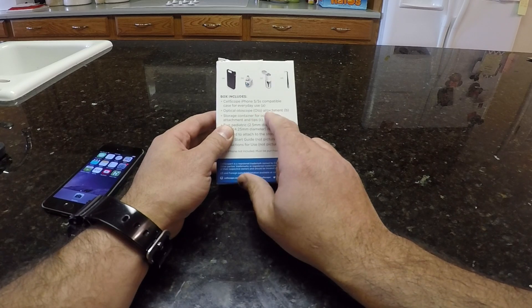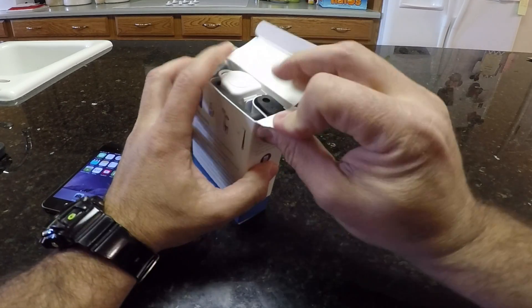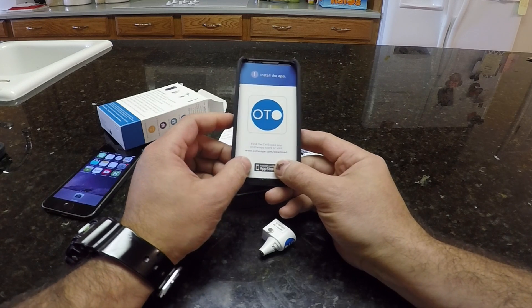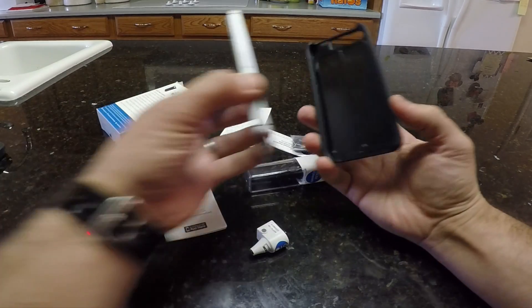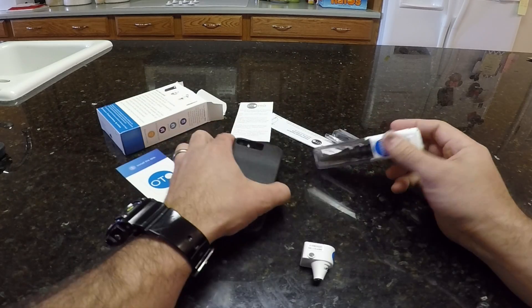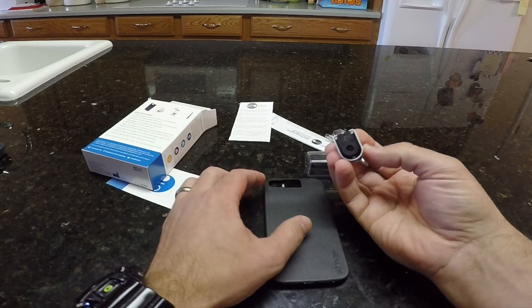The optical otoscope attachment, the storage container for the tips, pediatric tips and whatnot, a little cable to prevent it from falling to the ground. So it looks like a regular case. It's got that hard feeling to it. I like when they're a little bit more rubbery, but this is what's important — it has the special attachment for the light. The other cool thing is that it does include this here. That's so you can attach an insufflator, so you can do movement of the tympanic membrane by putting air in and out.